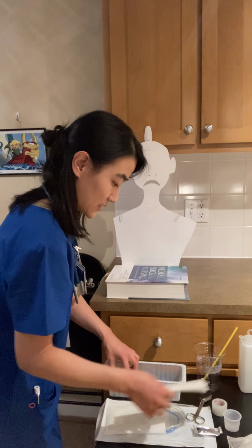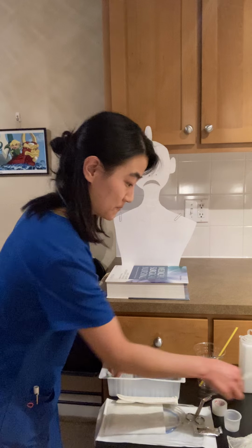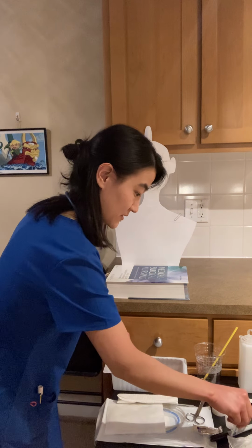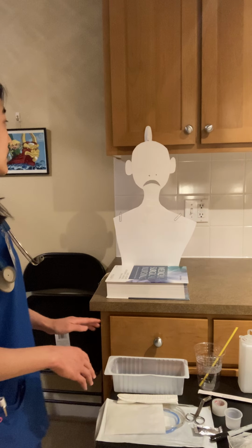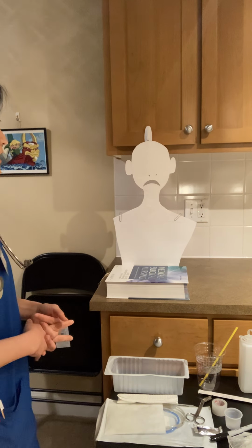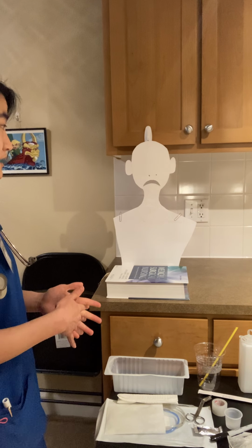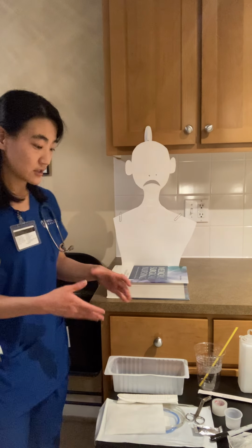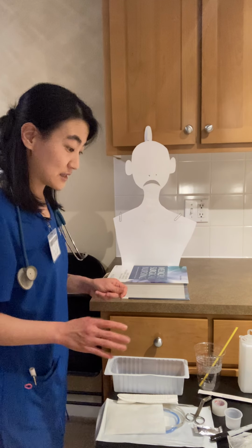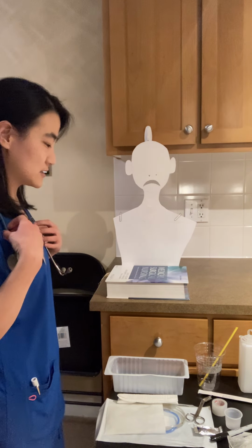So before we get started, I am also going to identify the patient using two forms of identification. So would you mind telling me your name and date of birth? And then he would answer with his name, Tran Nguyen, and his date of birth. And I would check against his wristband to confirm that he is in fact who he says he is.